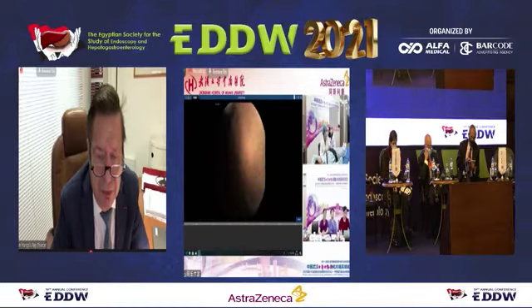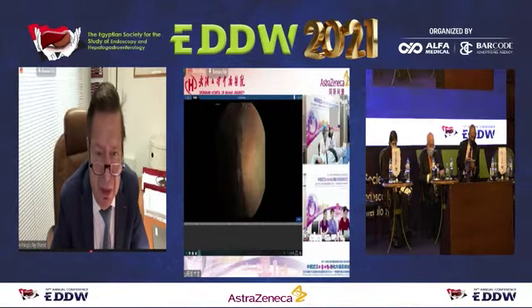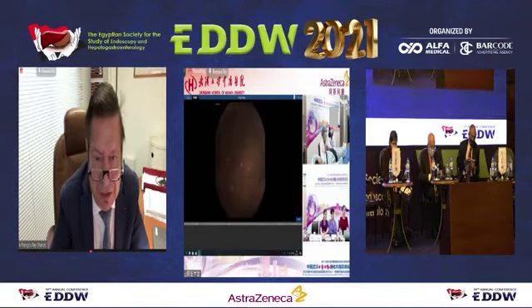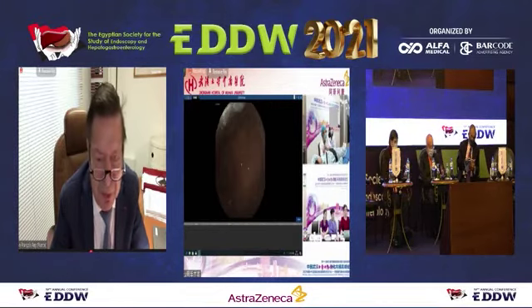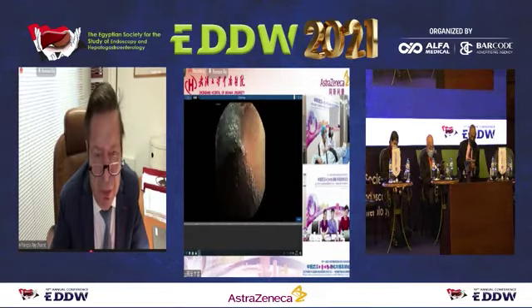We did the first clinical study 10 years ago with a capsule from Olympus Siemens, and we clearly showed in nearly 300 patients that the overall diagnosis from a capsule is exactly the same as gastroscopy.